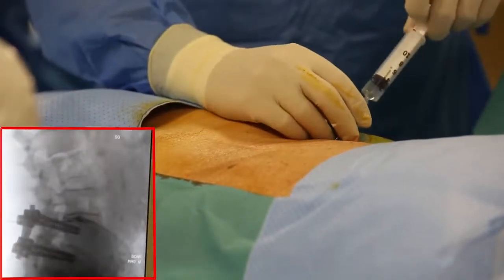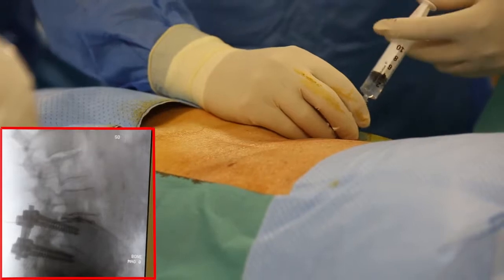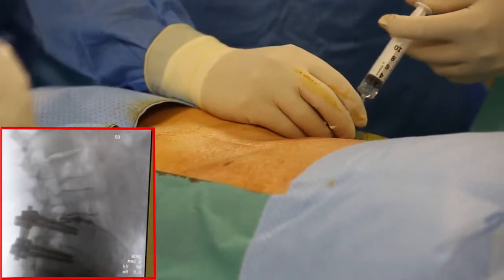Confirm that the position is correct by injecting contrast medium to perform a discogram. The monitor confirms that we are inside the disc and that it is herniated.